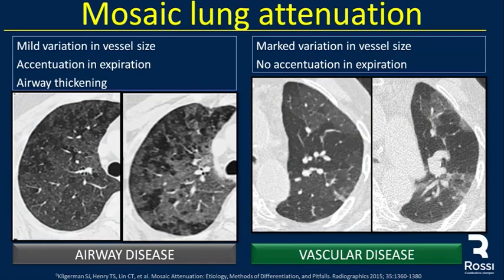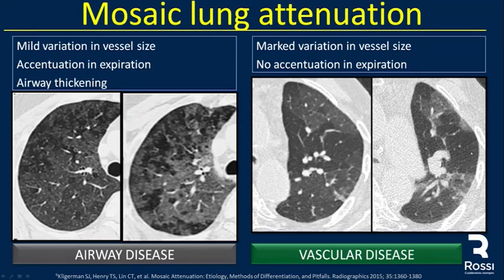In vascular disease, we see a marked variation in vessel size with enlargement of the vessels. There is no accentuation in expiration. We see the mosaic lung attenuation with areas of high and low attenuation, and that pattern persists without much change in the expiratory CT.